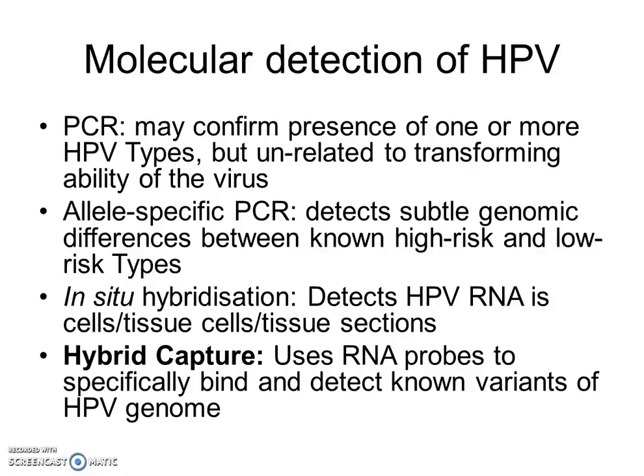but for reasons that I've already discussed, like the unidirectional workflow requirement for PCR-based technology and the generation of lots of PCR products that could contaminate future experiments, PCRs are not favoured in a cytopathology lab because the cytopathology staff there are not experienced molecular biologists. So they favoured this technique called hybrid capture, which doesn't generate any PCR product amplification.